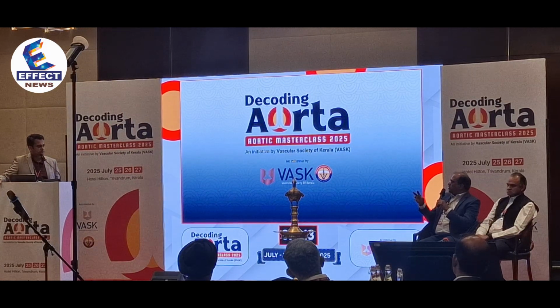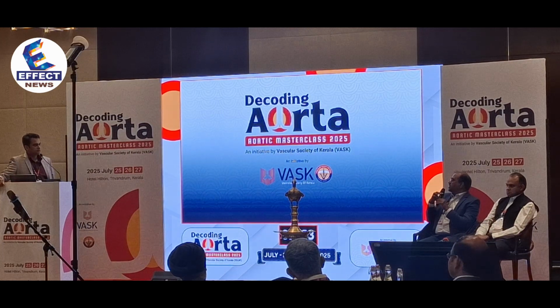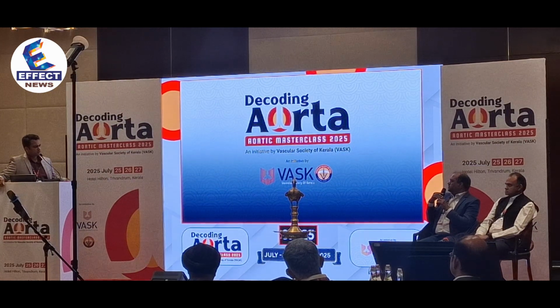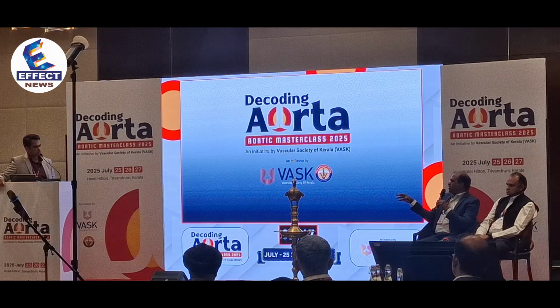So my recommendation would be to use time of flight. You can still get good results if you don't use contrast at all in any of the MRI peripheral, along with a plain CT. Especially if you are thinking about open surgery, you really don't need a lot of details. But I believe time of flight is not very good for aortic imaging as well as in peripheral.